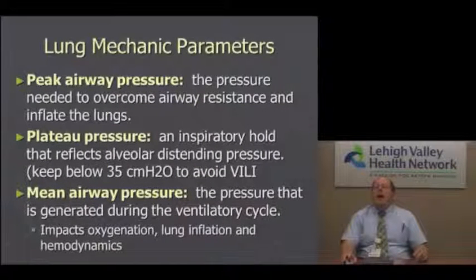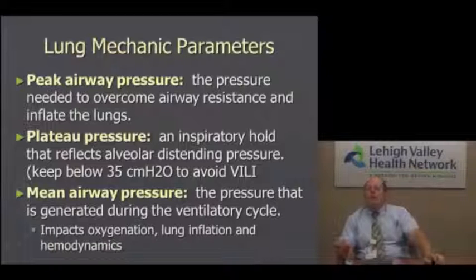All right. I'm just about finished with this section. I want to talk about these parameters, and then we'll take a little bit of a break. Lung mechanic parameters, I talked about this earlier: peak airway pressure, plateau pressure, mean airway pressure.